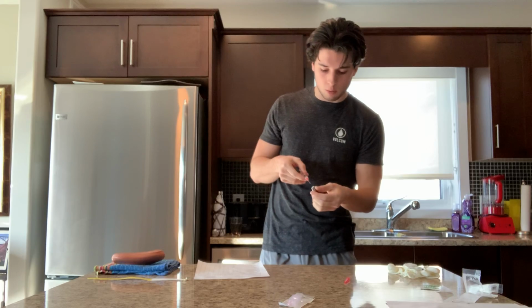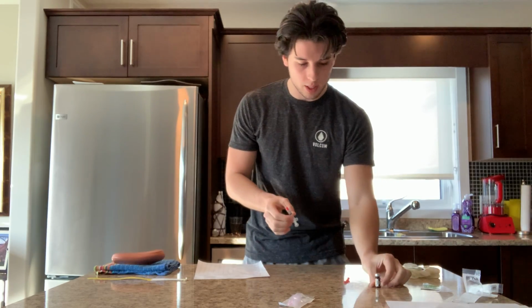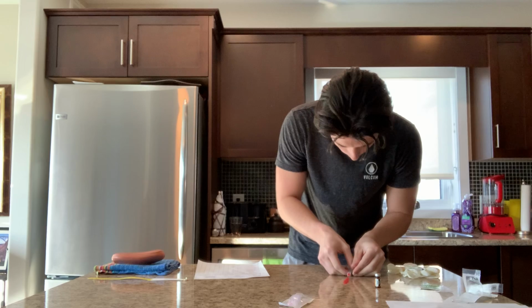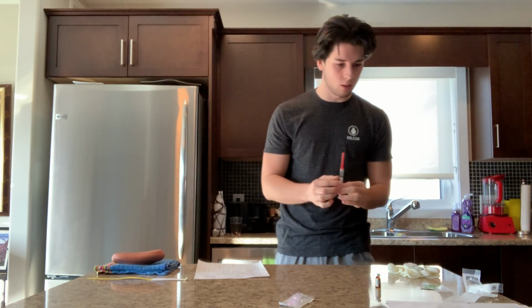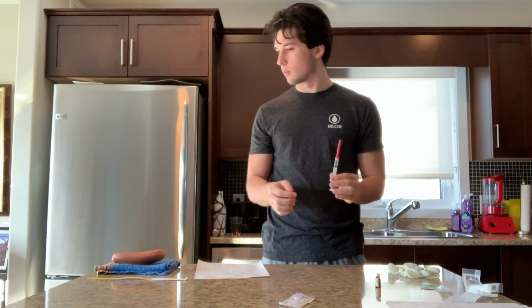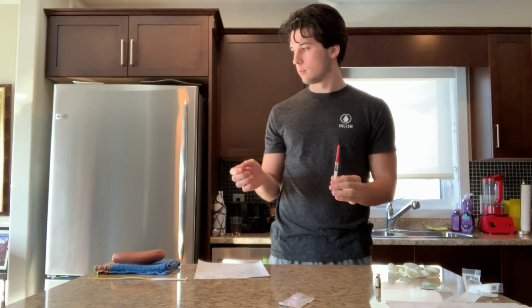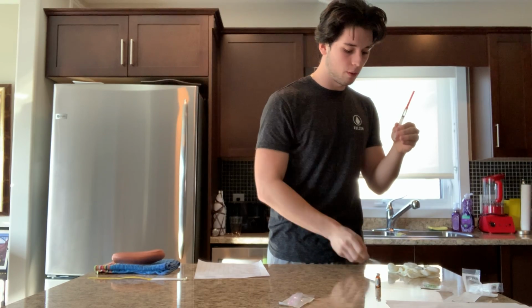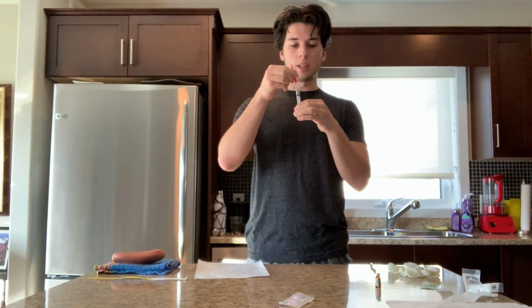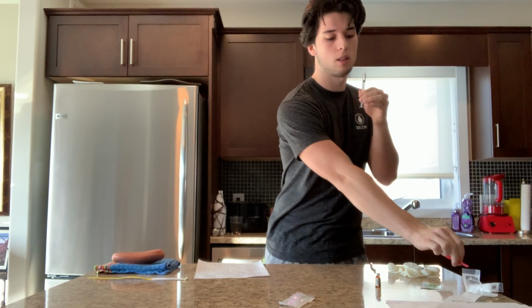Okay, and now that I have my 1 milliliter that's desired, I can recap my syringe. And here I'm going to grab a pencil or pen or something hard. Can you just grab me a pencil? So I'm going to grab a pencil and knock any excess bubbles out of the syringe. And once all the bubbles are out, I'm good to go, and I can remove my blunt fill needle. I can remove this and deposit it directly into the sharps container. So that will go in sharps, and then I'm ready to grab my injection needle.